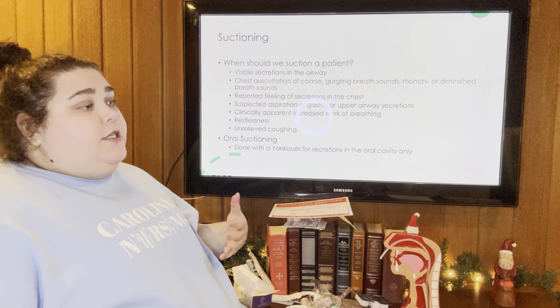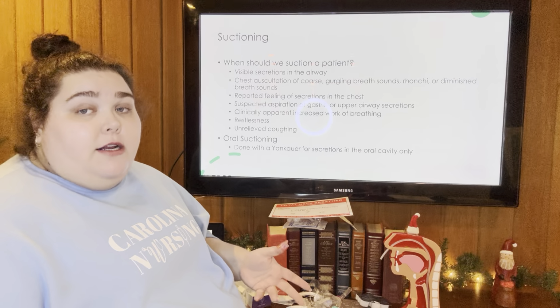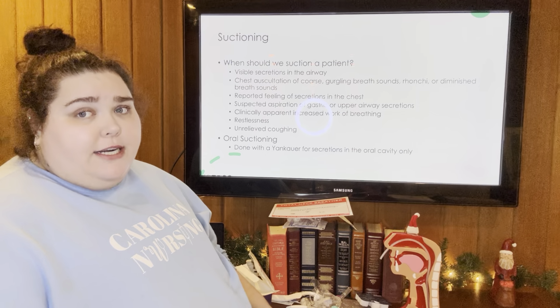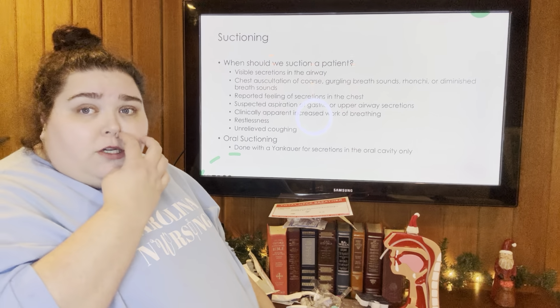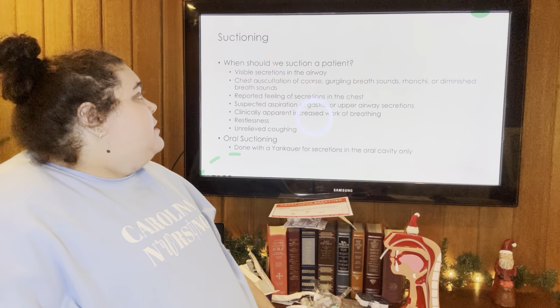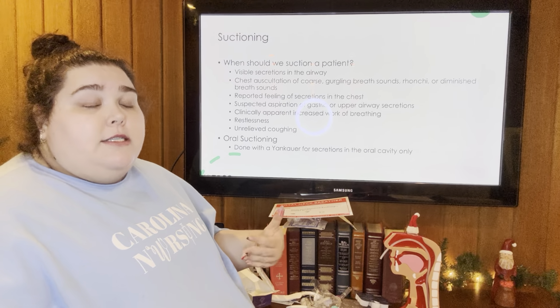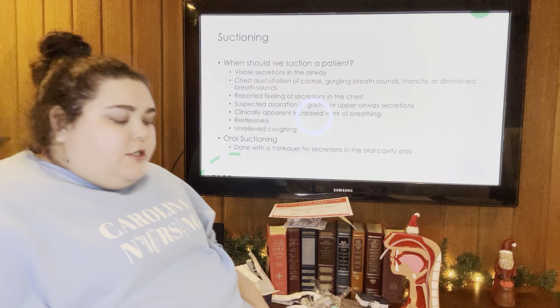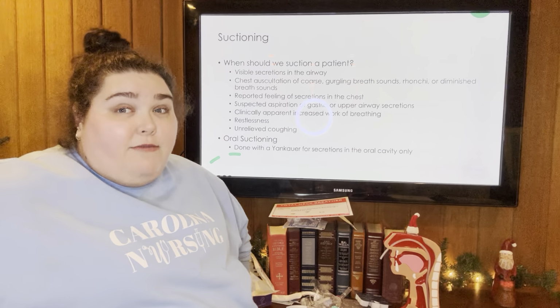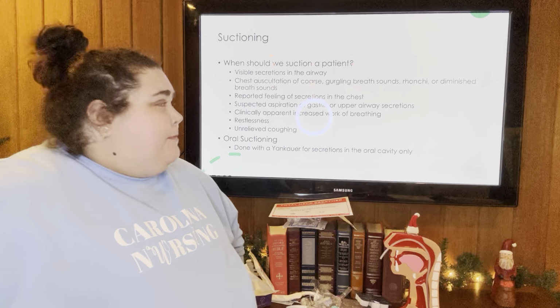So like we talked about, some patients are suctioned once a shift, some are suctioned once an hour. It just depends on how many secretions they have, and it really heavily depends on where they are in their trach journey. Like the earlier the trach, the more secretions you'll have. The longer it's in, the more it adjusts. So we don't want to just suction a patient willy-nilly. You can cause more secretions by doing that. If we're suctioning a patient super frequently, we can cause them to have more secretions over time, which causes a rebound effect. So we want to make sure that we're doing it mindfully.